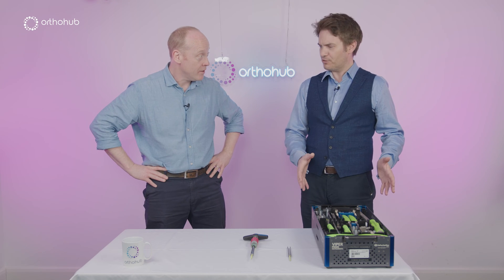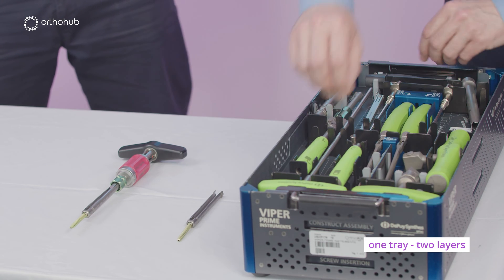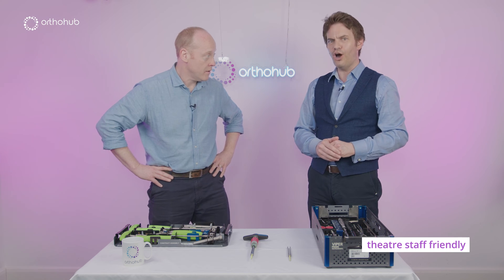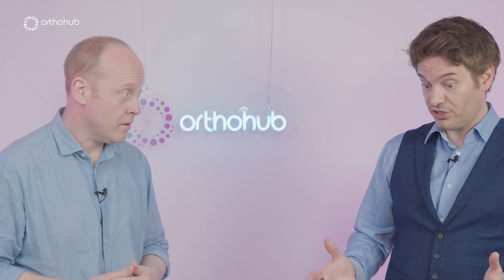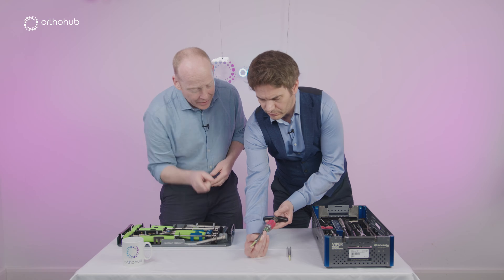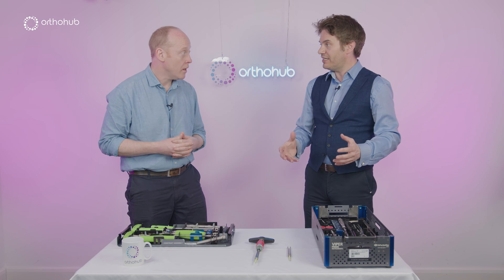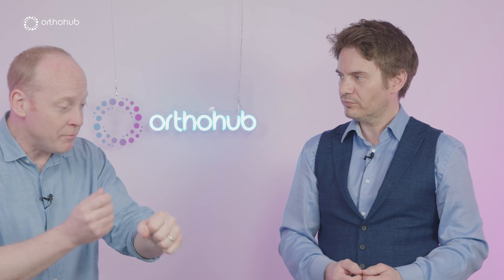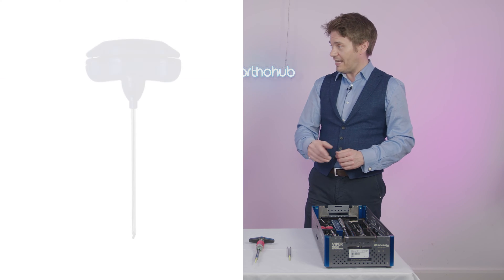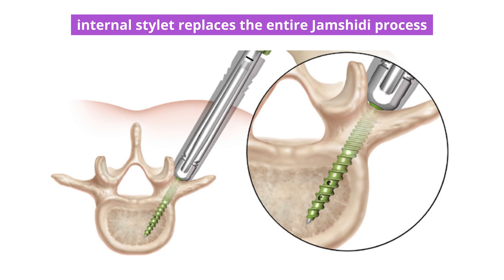There are two take-home messages for this pedicle screw system that set it apart from everything else. The first, you can already see: it comes in one tray, and that's truly unique — theatre staff love you for it because we've not got the multiple trays spine surgeons are used to. The second thing, the real appeal to surgeons, is the screwdriver and pedicle screw with an integral stilette — a jamsheedy inside the pedicle screw — so instead of a separate jamsheedy, wire, and screw-over-wire sequence, it's all in one. It saves seven steps.